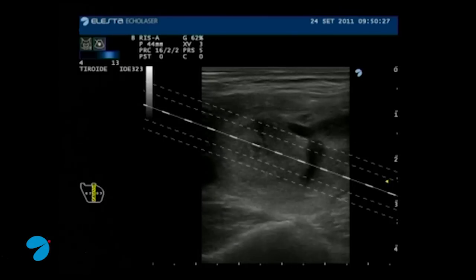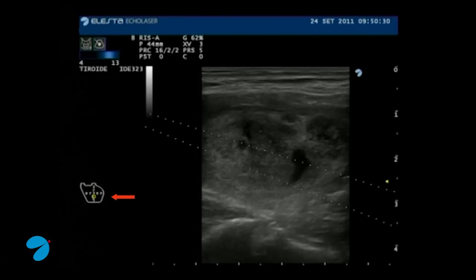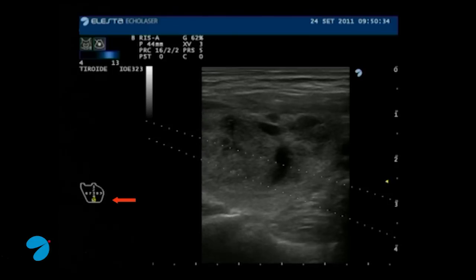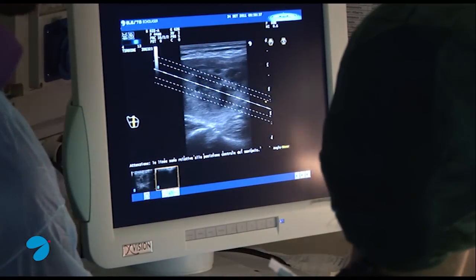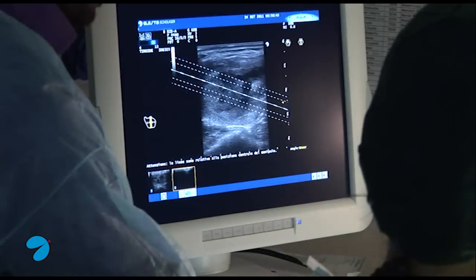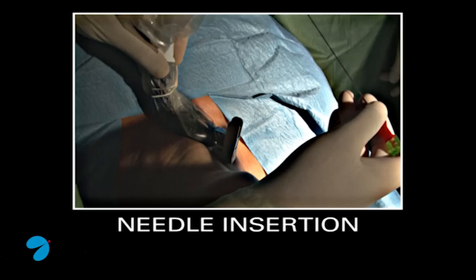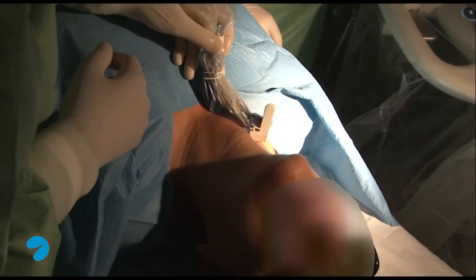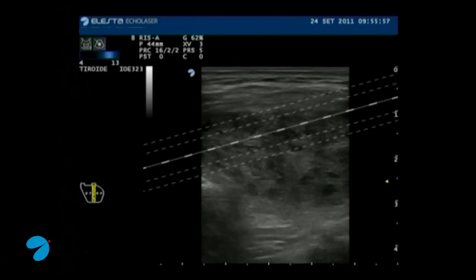It's possible to have different needle insertion cones on the screen. Five lines exist that correspond to five needle insertion points in the guide system. In this phase, the guide system is placed on the patient's neck, proceeding to needle insertion.